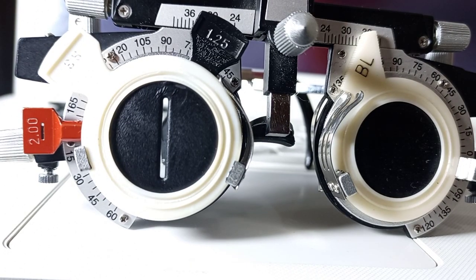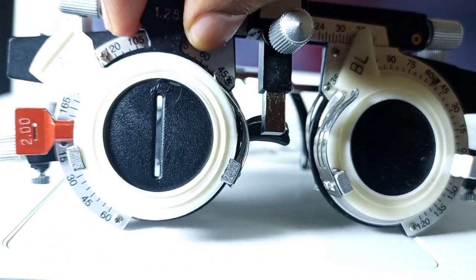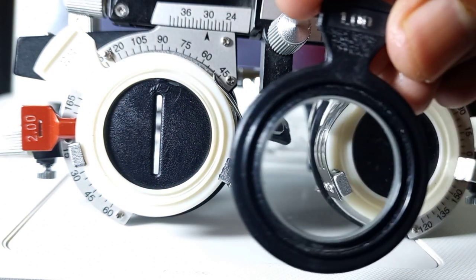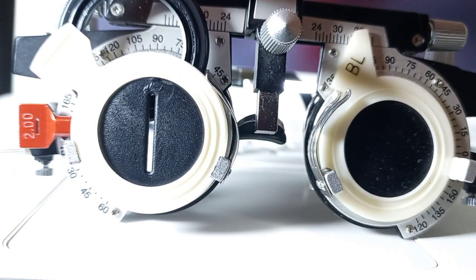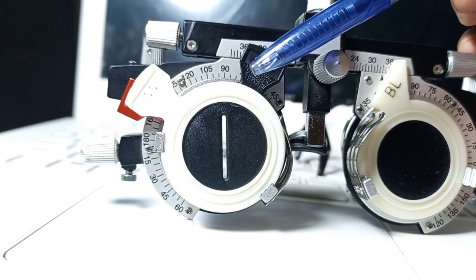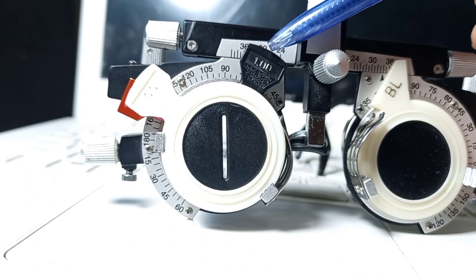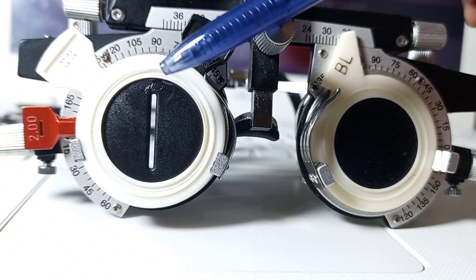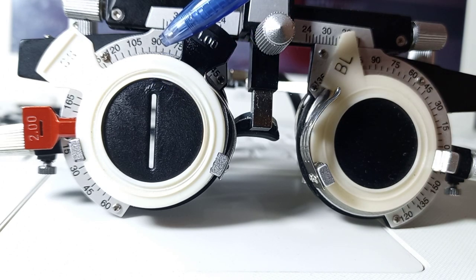We will continue reducing the fogging lenses until the patient gets maximum visual acuity. I will put plus 1.00 spherical before the patient's eye. Suppose the patient has gained maximum visual acuity at the first principal meridian at 90 degrees, so our residual fogging lens at the first principal meridian is plus 1.00. You have to keep this in mind.